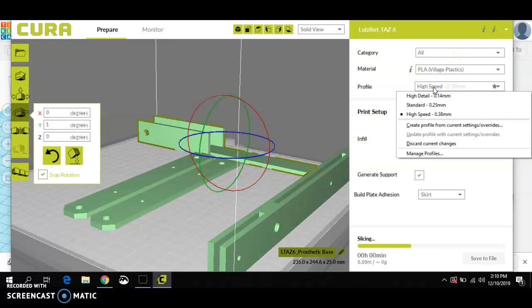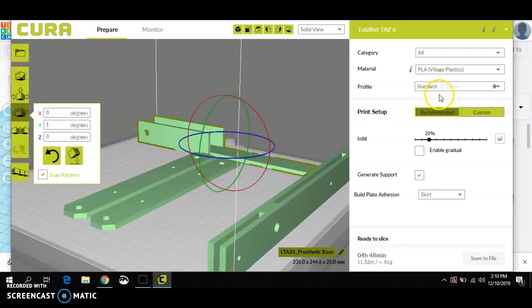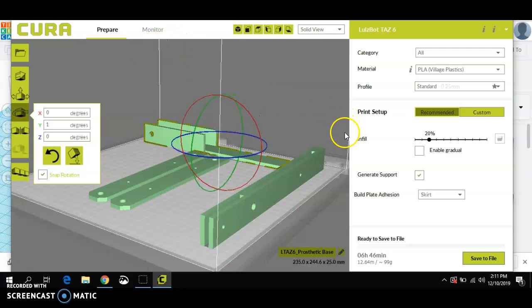You can print high speed. That usually comes out pretty well. I generally print standard. I almost never print high detail. That will double the print time necessary. So this is critical. A couple other things. You always want to make sure that you're set for the Lulzbot Taz 6. The material is probably the second biggest cause of a print fail. Okay, the last step is to save to a removable SD card so this file can be brought over to the printer.